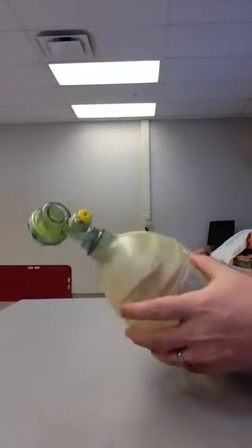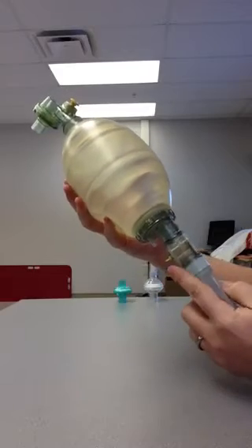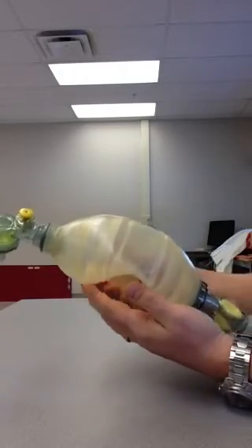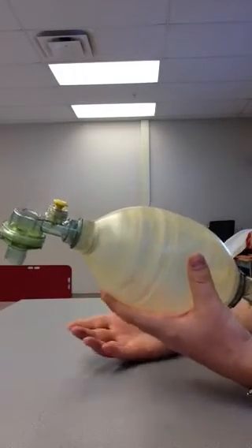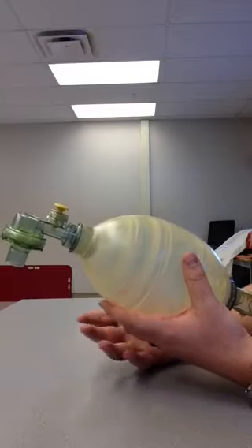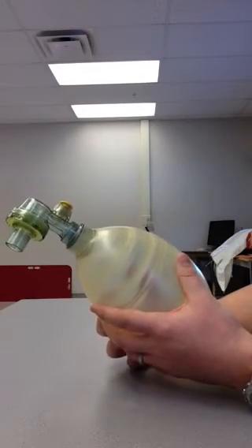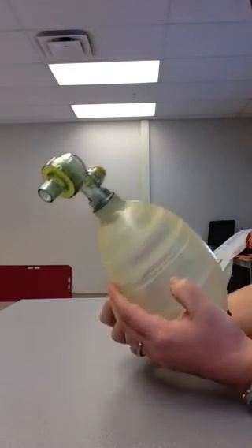If you didn't have an oxygen source, one feature of these self-inflating resus bags is that you can still ventilate. You can see I don't have an oxygen source attached right now — every time I squeeze the bag, if it's assembled properly, it re-inflates and I can ventilate my patient with 21% ambient oxygen. That is one advantage of a self-inflating resus bag: in a pinch, you can use it with room air.